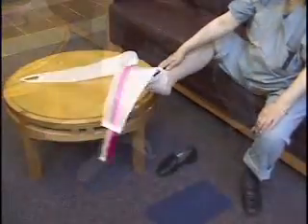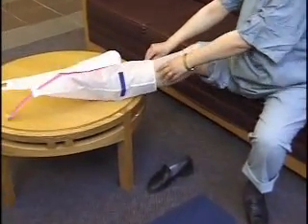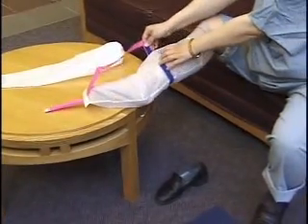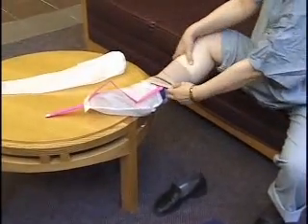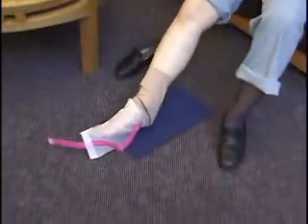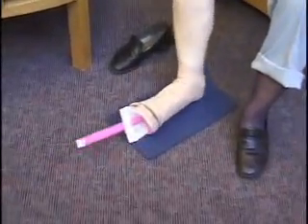These stockings are very difficult to remove, but using the table and a remover, this process is greatly simplified. It is important to pull the remover all the way up the leg and then to fold down the stocking far enough so that the stocking end goes over the heel. Once this is accomplished, a simple scraping motion can be used to remove easily this stocking in about 15 to 20 seconds.